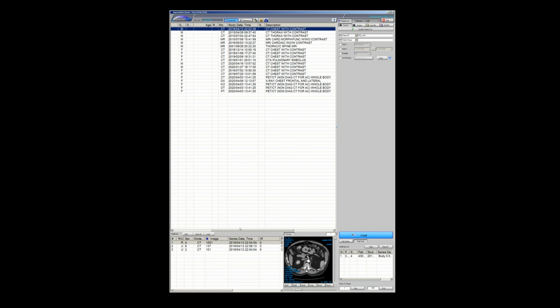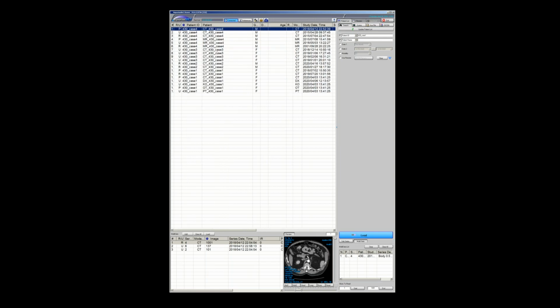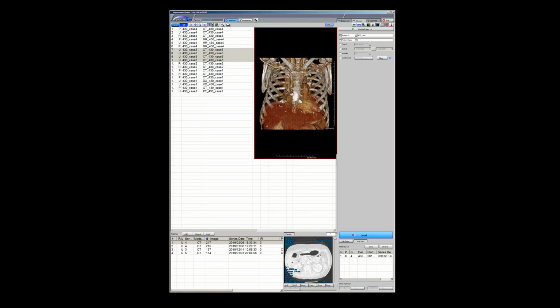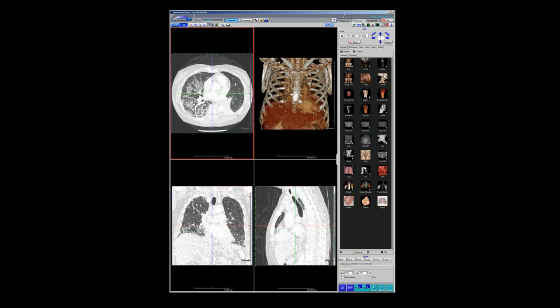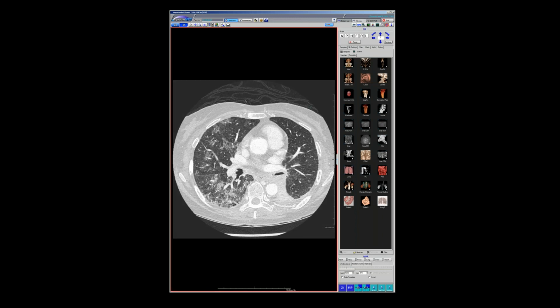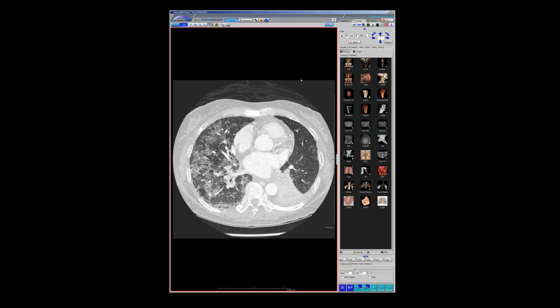I don't know how many other people have seen the natural progression of lipomatous hypertrophy, but I thought that was interesting. Was there anything interesting in the pathology, since you said he had a debulking? Did they comment? No, they just called it a lipoma, which they always do because they just get a ball of fat.